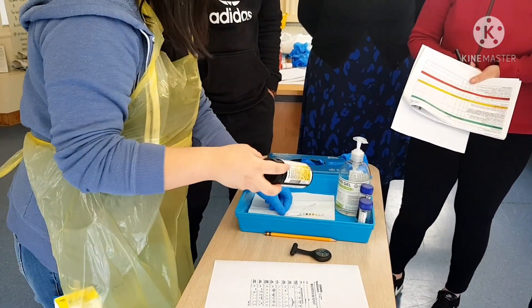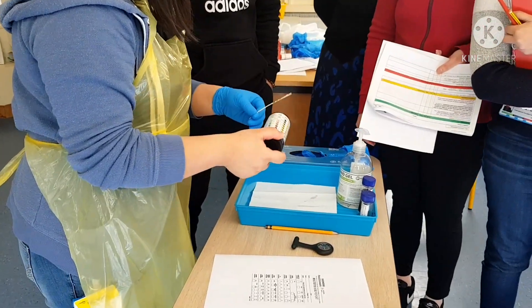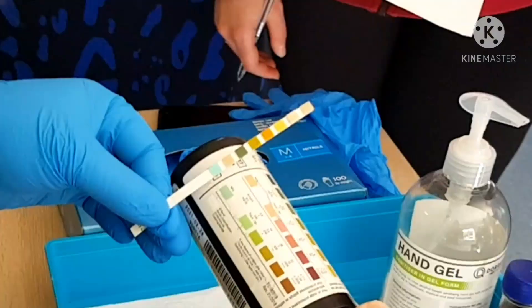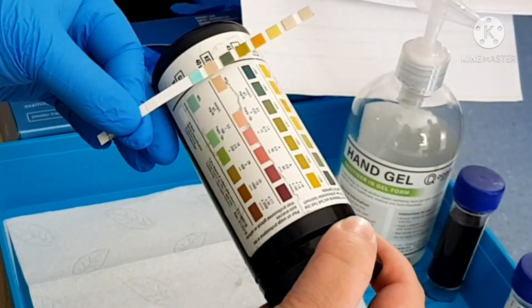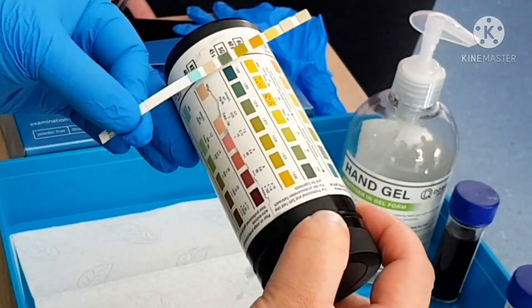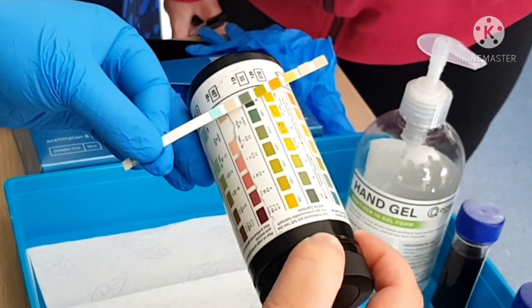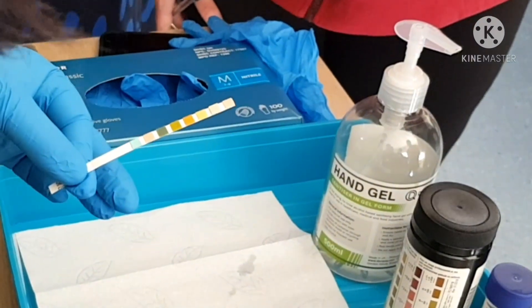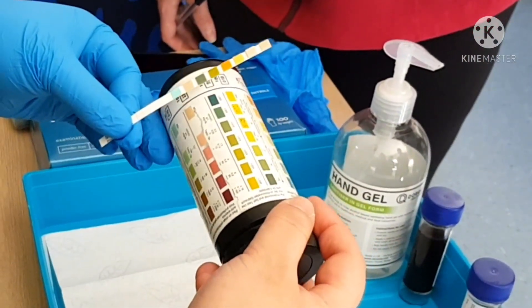Mr. Assessor, it has been 30 seconds, so I'm now going to start reading. My glucose is negative, my ketones is negative as well. Following that, the specific gravity — the urine specific gravity is 1.005. So it's negative, negative, 1.005. It's been 1 minute or 60 seconds, so I'm now going to continue reading.